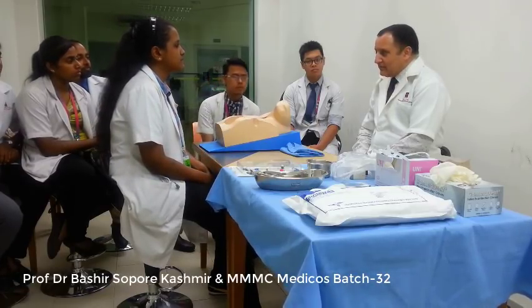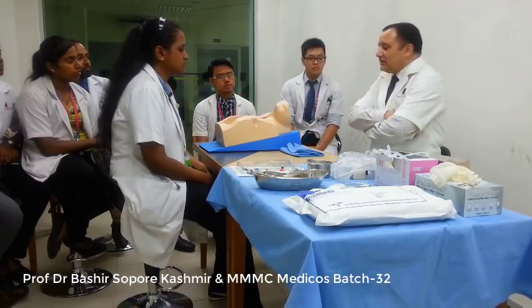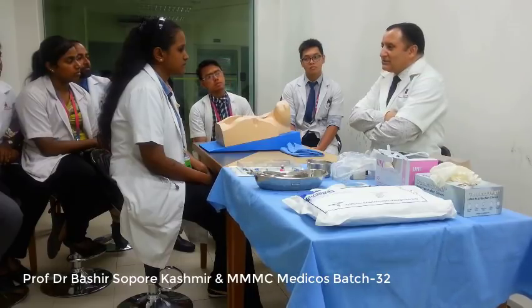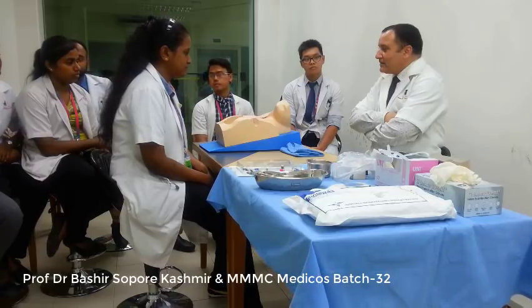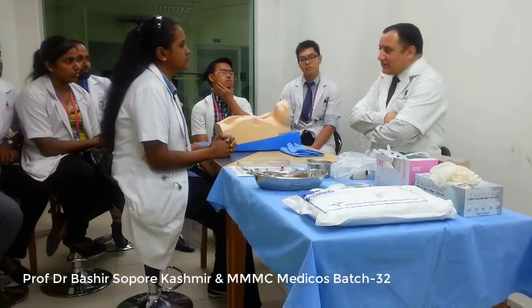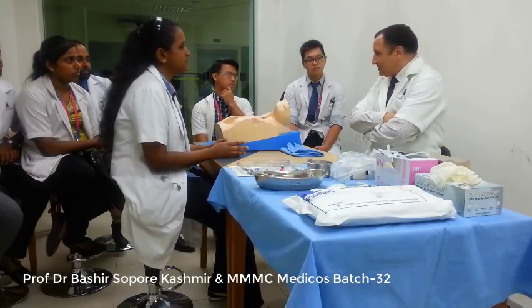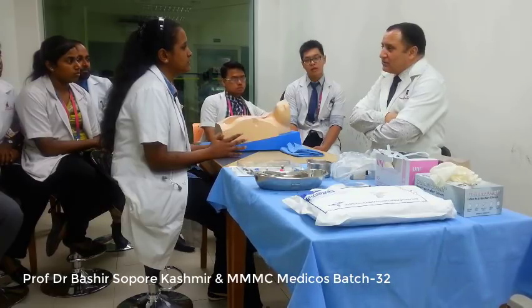Now let us talk about indications of central venous catheterization, or indications of jugular venous catheterization. The indications are central venous pressure monitoring, hemodialysis, plasmapheresis, and insertion of pulmonary artery catheter.